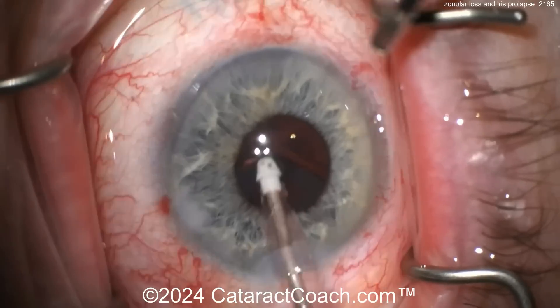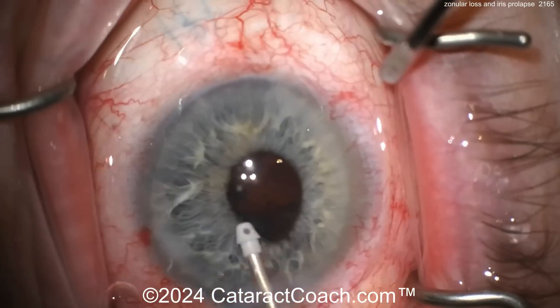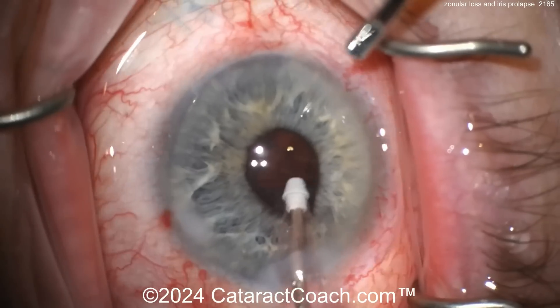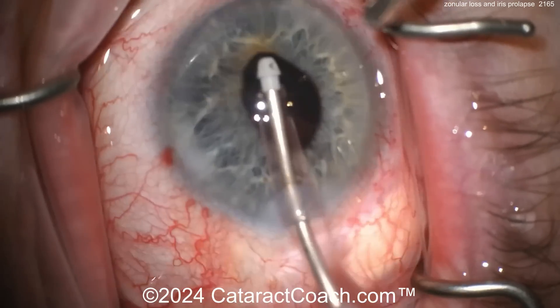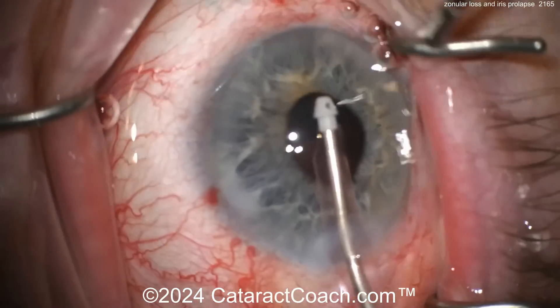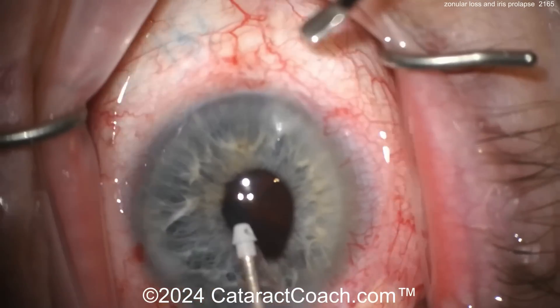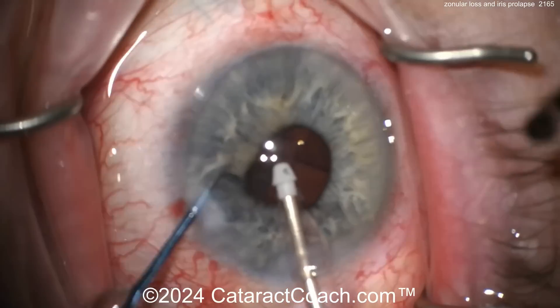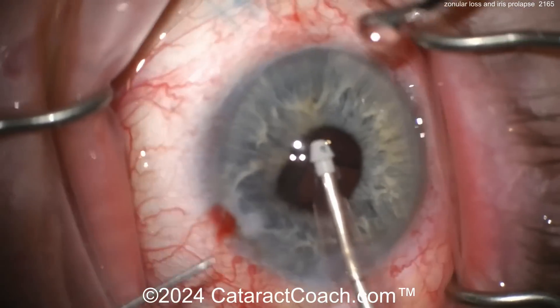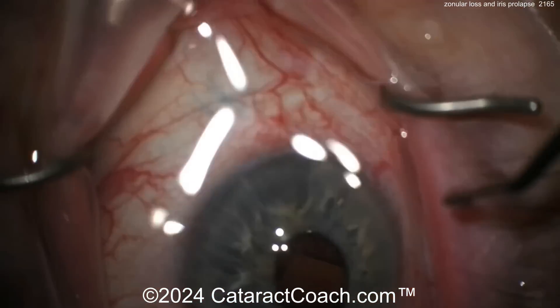Watch carefully as you're moving this cortex — the view is really tough. You may want to have the second hand in there to lift up the iris, so you're going to have your chopper through your paracentesis to lift up the iris and give yourself a little better visualization to see what's going on. Otherwise it's a much tougher procedure. There's the second instrument — good idea. But oh, look at the iris wanting to prolapse. More viscoelastic.